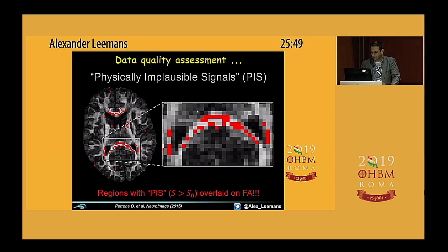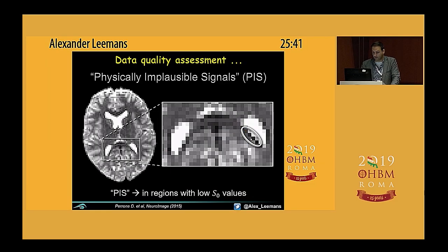If you know that, let's look at the raw data and focus on these 4 voxels for simplicity. Here on a non-diffusion-weighted signal, you can see the same 4 voxels, and they're indeed very dark, right? And it seems to be near CSF regions that you see these dark voxels. So what is that artifact?